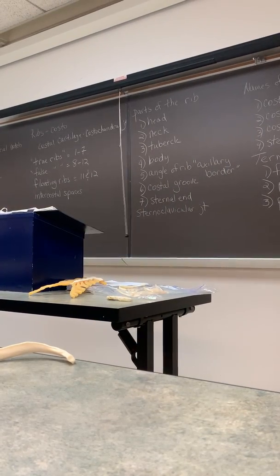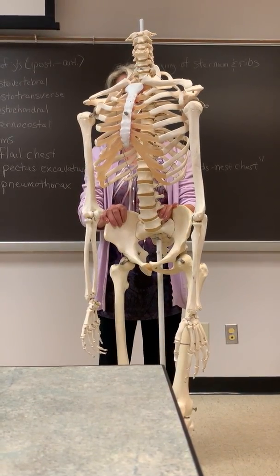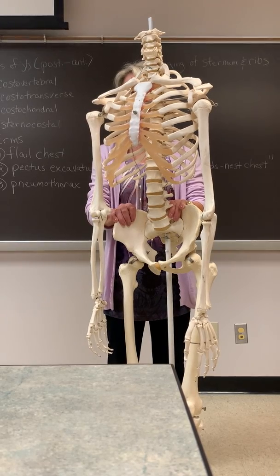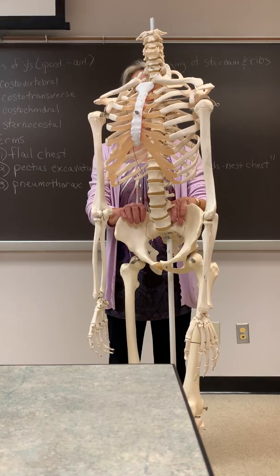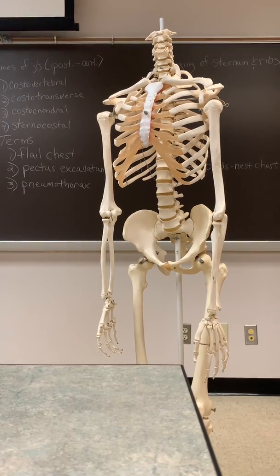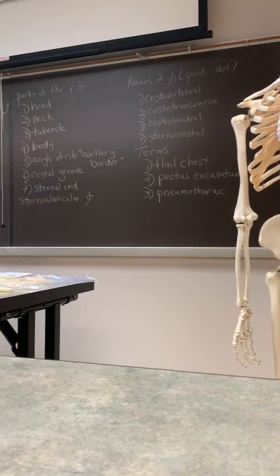So for POs, it's the affected side down, and for AOs, it's affected side up. Did I say it exactly opposite? Sorry. Good idea, Drew. So affected side down in PO and affected side up in AO? Correct. All right, everybody got that right?